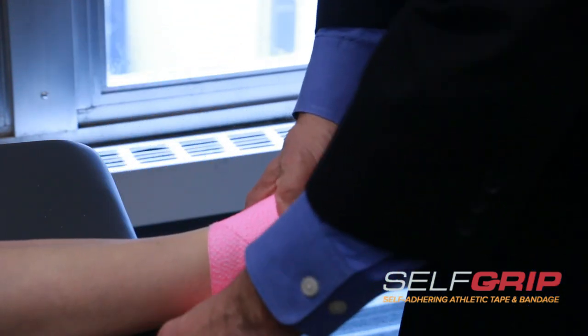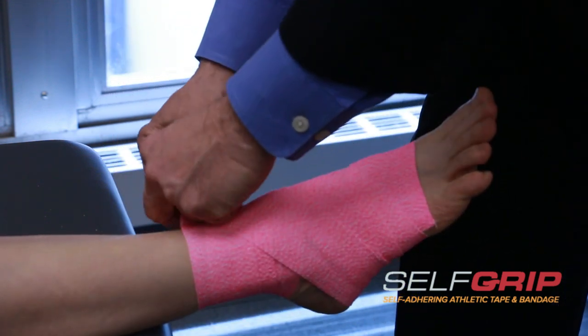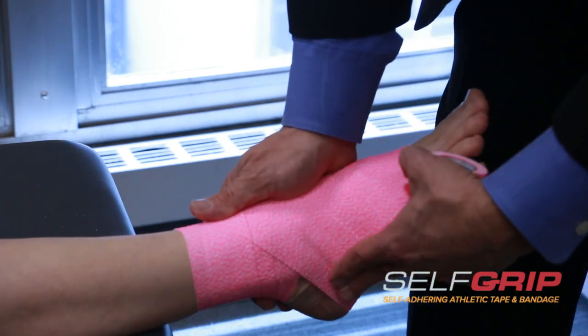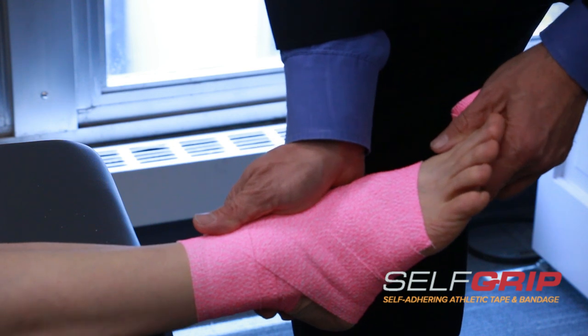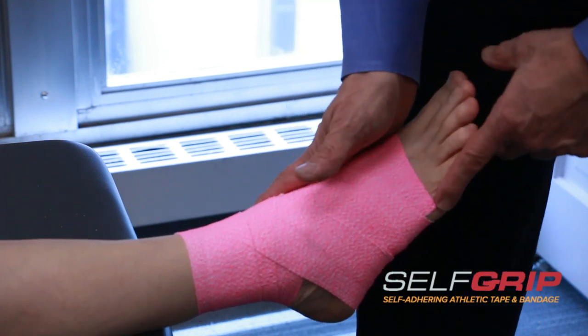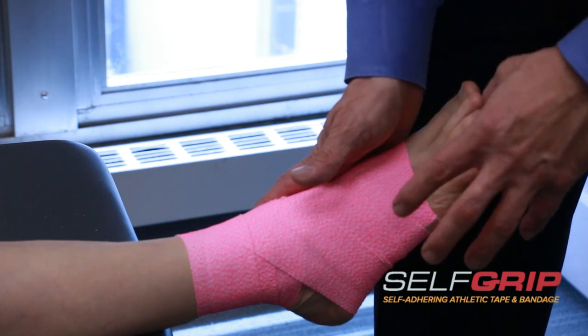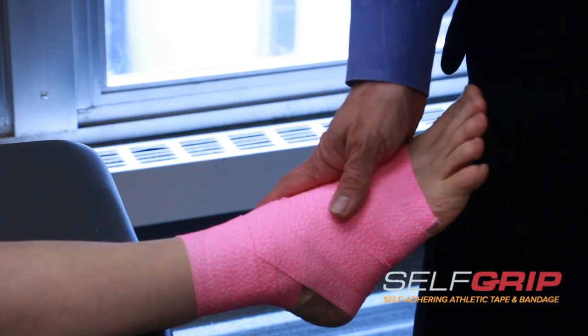We're going to wrap it up in this region and lock it in. There we've got some excellent support of the outside of the ankle, and you can see the foot being pulled a little bit this way. So when she is walking or running, we have a support system that will help prevent and support an outside ankle strain.